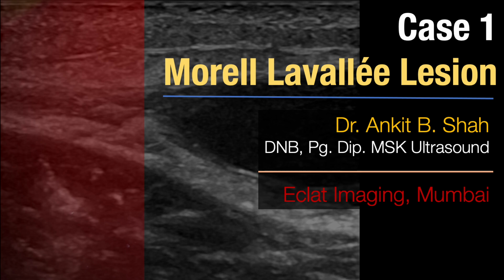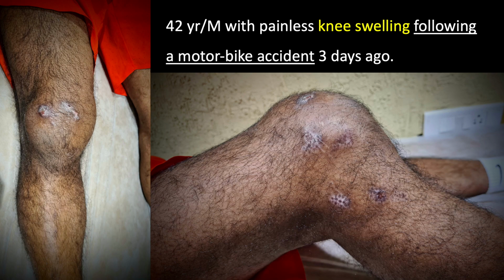So, starting with this case, we had a 42-year-old male with a painless knee swelling following a motorbike accident which had occurred 3 days ago. Here we notice a prepatellar swelling extending to the superior medial aspect of the knee joint. We do see some healing abrasions over the anterior and lateral aspects of the knee as well.